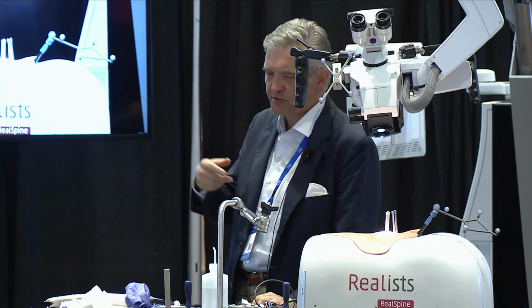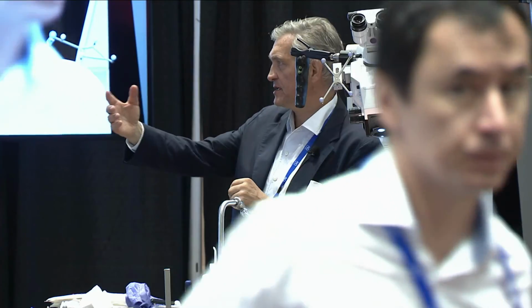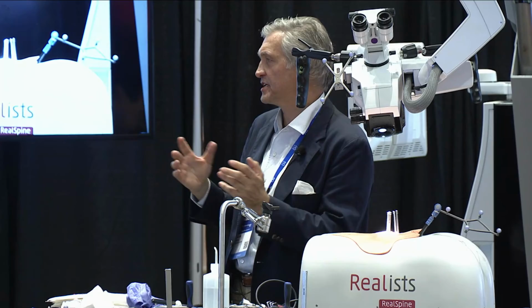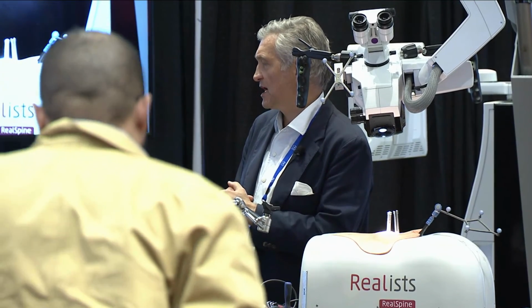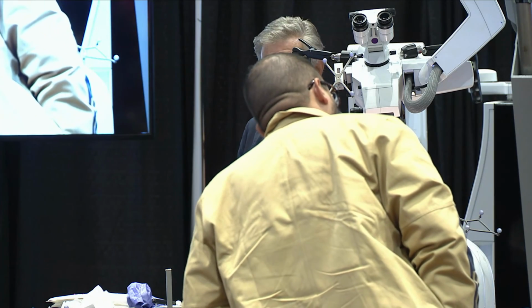When you do the discectomy, the tube is going to determine how far medial, how far lateral, and you can modify that with navigation. So yeah, absolutely. It's important to have in mind since the beginning the way you want to go. Great. Absolutely, yeah. Nice.